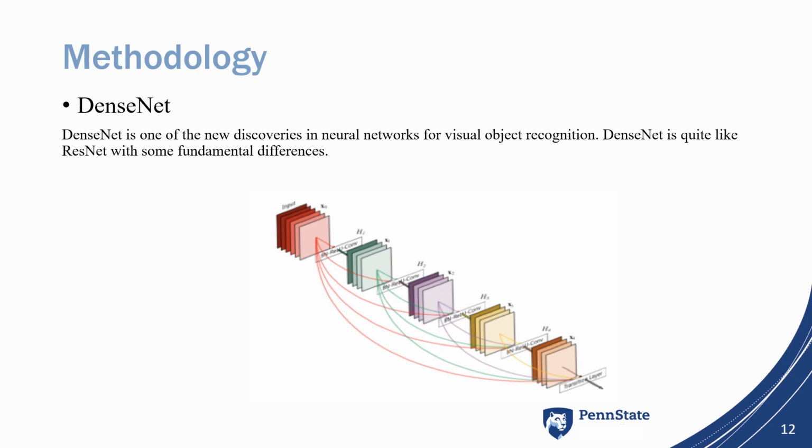DenseNet was developed specifically to improve the decline in accuracy caused by the vanishing gradient in high-level neural networks. In simpler terms, due to the longer path between the input layer and the output layer, the information vanishes before reaching its destination.